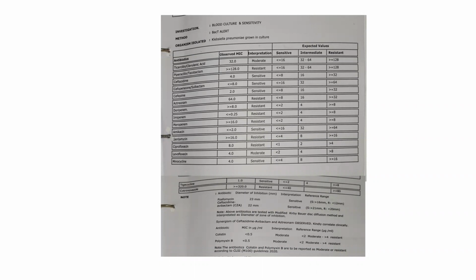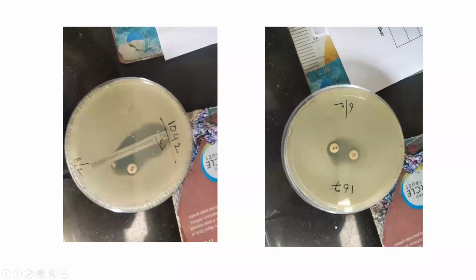Sir, in the same report, I read "synergism of ceftazidime avibactam and aztreonam observed, kindly correlate clinically." Can you guide us through what this line means? Yes. Can you move to the next slide, please?